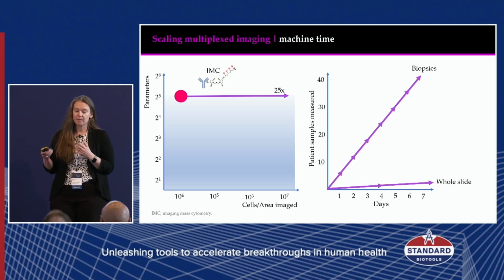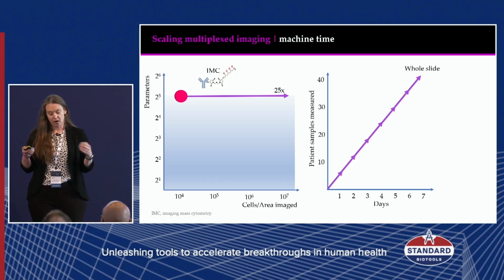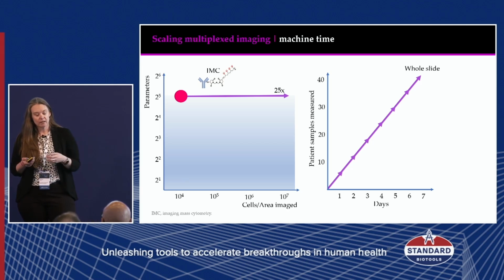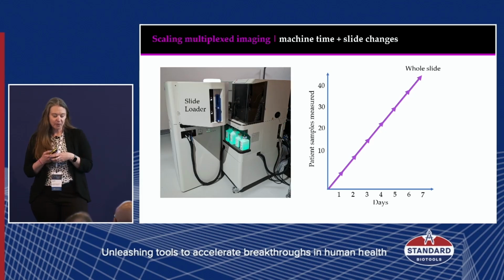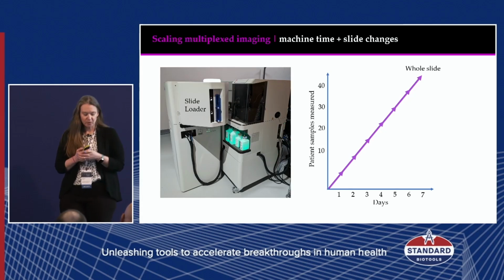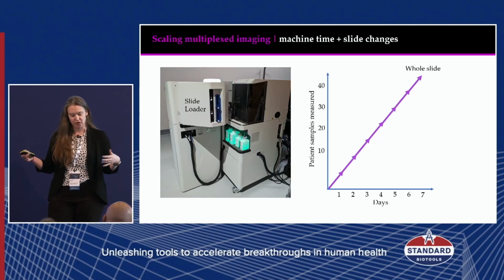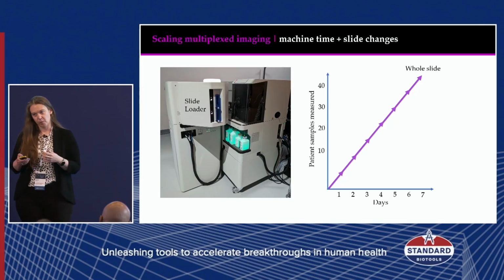Hopefully that's going to take us from what was this to many more whole slides across a single week. The second thing is how we interact with the machine. We just saw the slide loader, so I won't go into detail about using this, but we've been lucky enough to be testing this with Standard BioTools. This allows you to get through overnight or through the weekend without someone having to be physically there to change slides, which, for those of you who have run it, is always at an inconvenient time, whether that's 2 a.m.